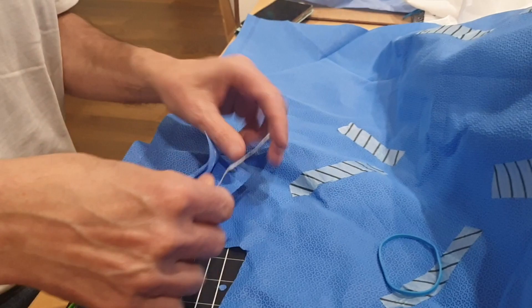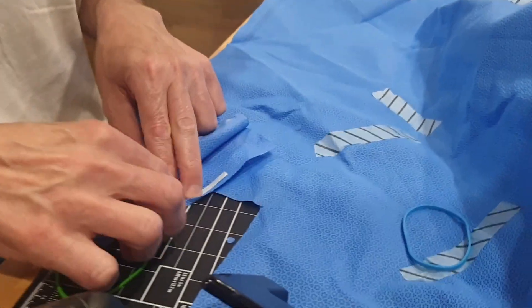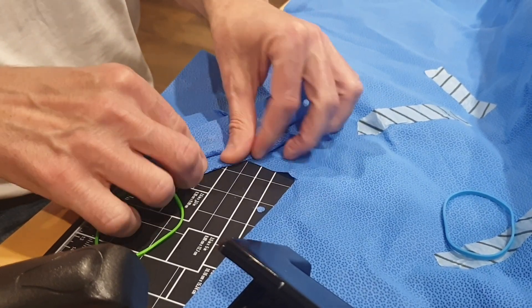Now use a simple twist tie or other flexible metal strip and place it on the top layer of the mask and secure it with staples. This will serve as the nose piece.